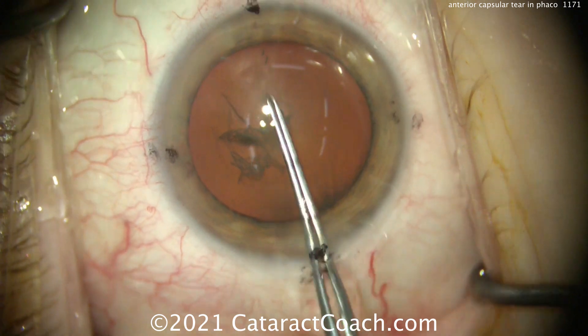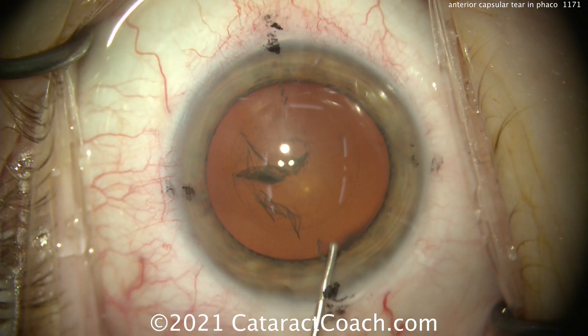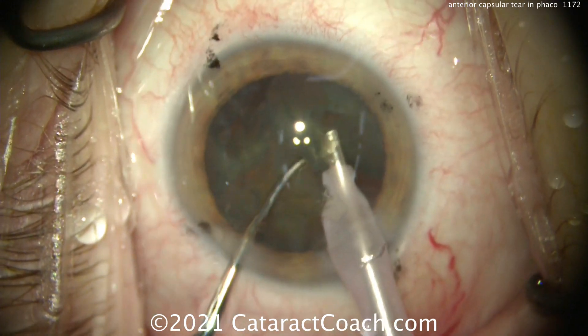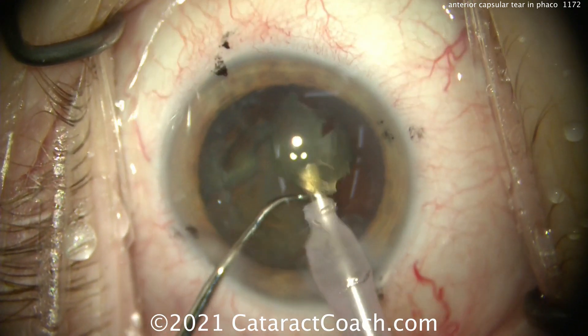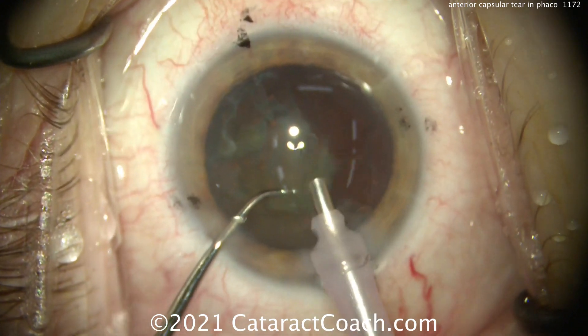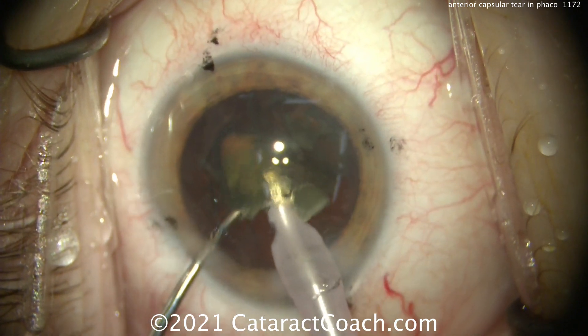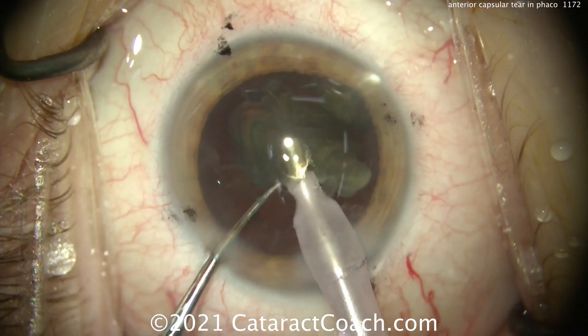But what's going to happen? During cataract surgery, during FACO, we're going to get a rip in that anterior capsule. Here's approximately where it happens — we're working in that area, bringing the nuclear pieces out of the capsular bag. Now remember, the anterior capsule is very thin. It's a little bit thicker than the posterior capsule, which can be 4 microns at its thinnest. The anterior capsule is somewhere in the range of about 14 microns, but still very, very thin.